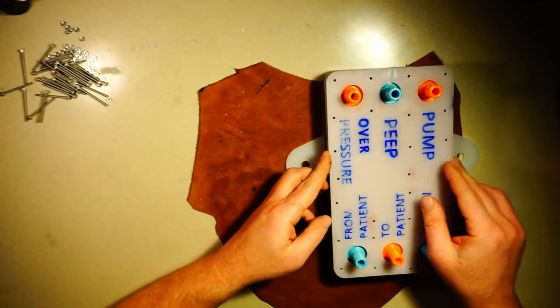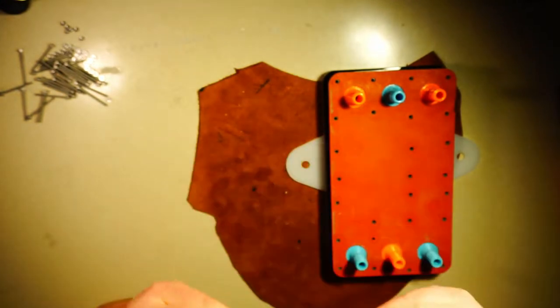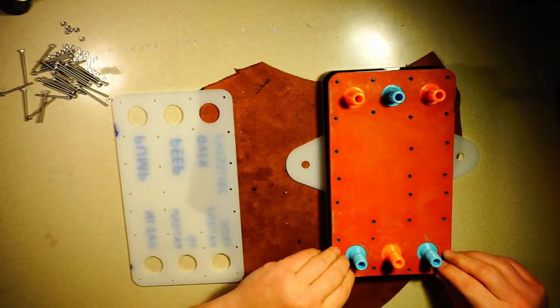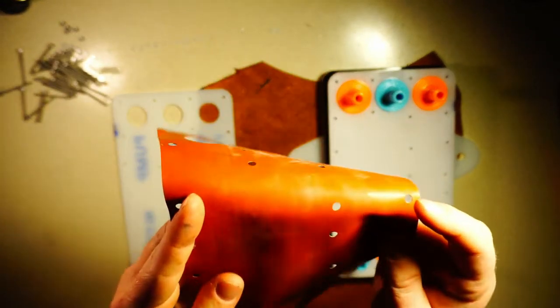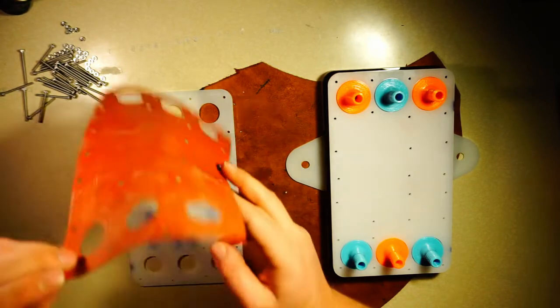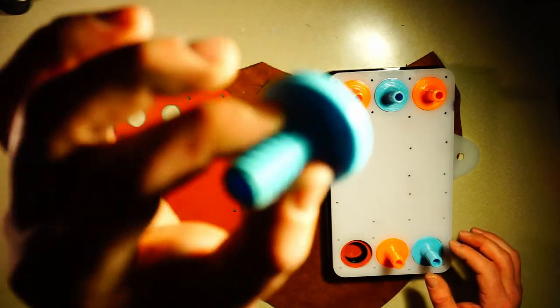Okay. So the first thing we have, oops, they're a little stuck. Break them apart. Okay. So the first thing we have is the faceplate. This just holds these ports in place. I'm going to flip it over here. The next thing is we have a silicon gasket. All of these silicon gaskets are 0.5mm thick silicon. They can be easily sterilized. Let's try and keep these in the same direction. Okay. Then we have these ports here.